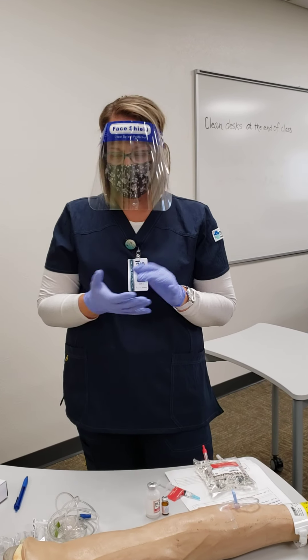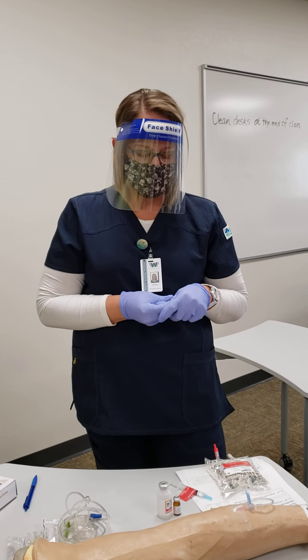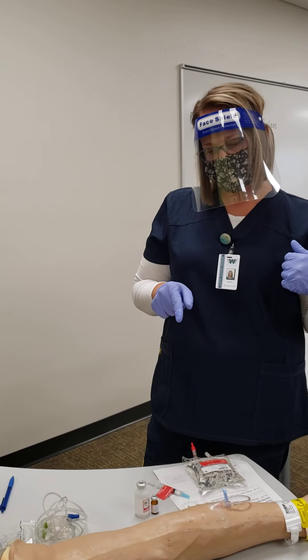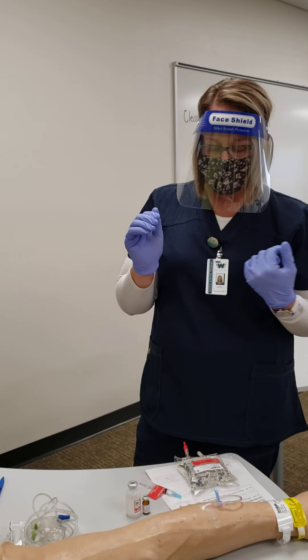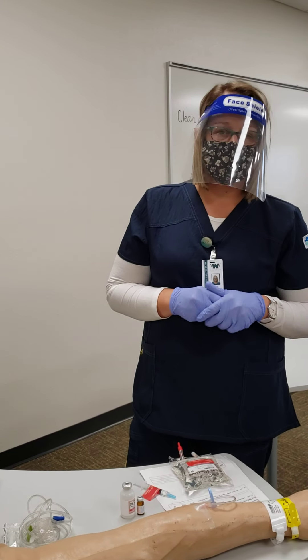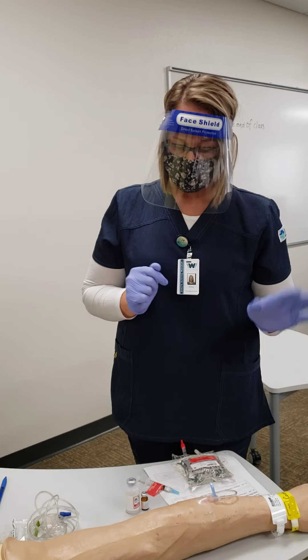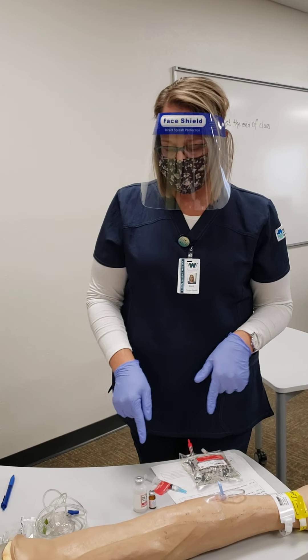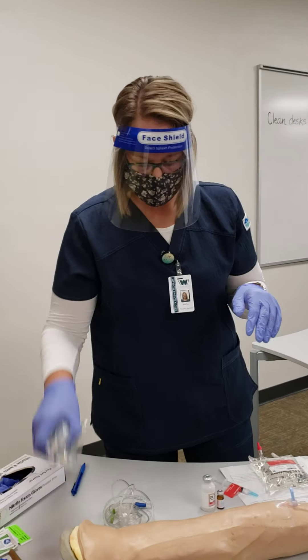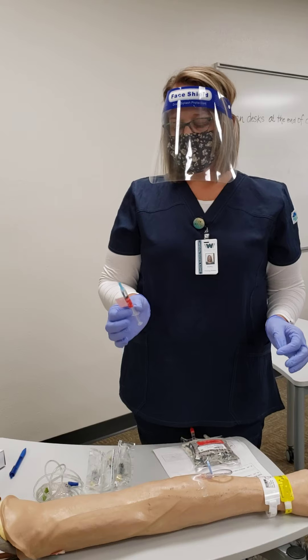How are you feeling today, Shirley? What's your pain at today? A 10 out of 10? The doctor has ordered some morphine sulfate for you, so we're going to go ahead and give that to you. I want to check your IV first to make sure there's no infiltration, redness, or swelling, and everything is working correctly before I give you any medication through the IV. I'm going to do my hand hygiene, scan my medications in, and put gloves on again. I have my saline flushes. Medications are scanned; the first thing we're going to do is the morphine sulfate.